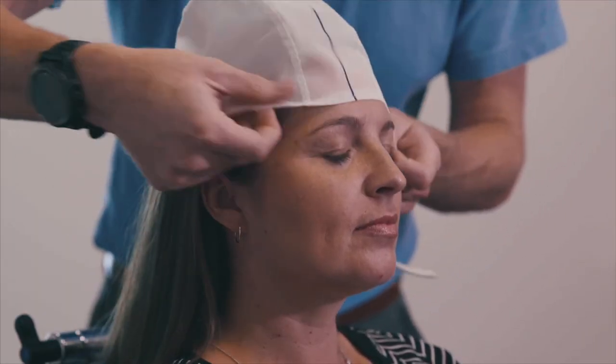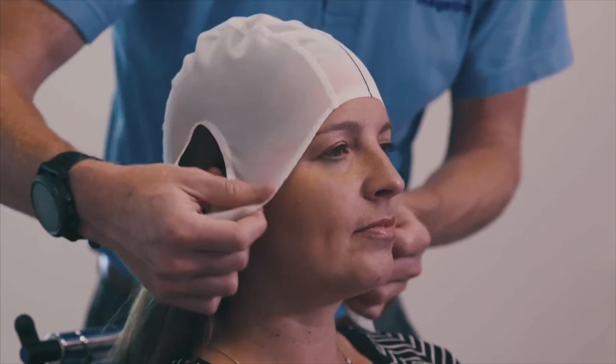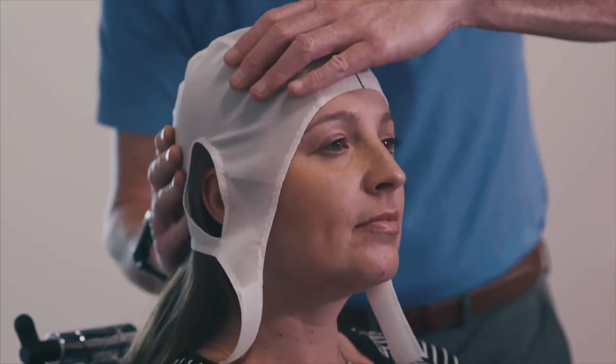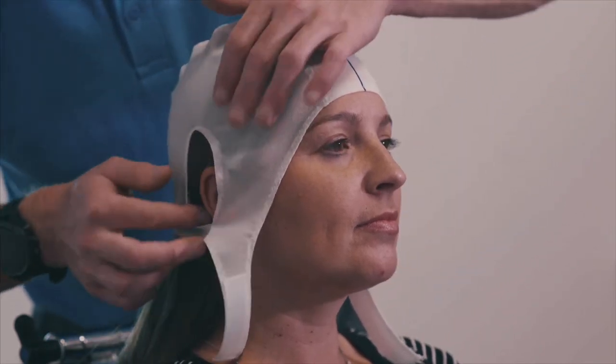Fit the patient's TMS cap, ensuring the ears are visible and positioned in the ear holes of the cap. The midline marker of the cap should be aligned with the centerline of the patient's head.